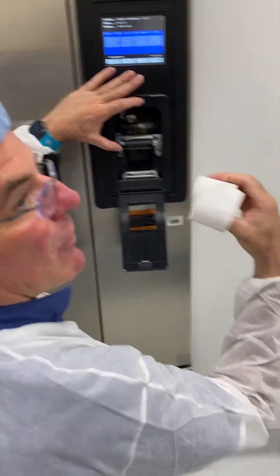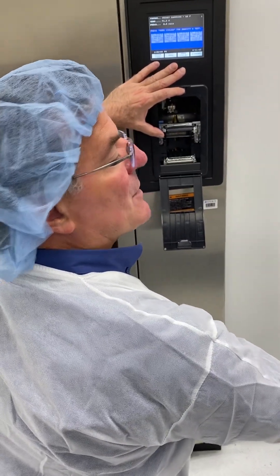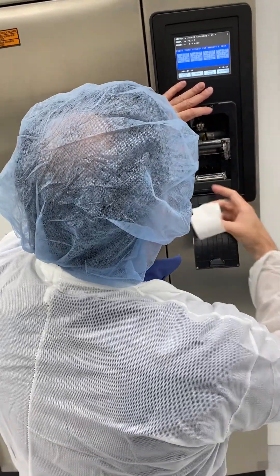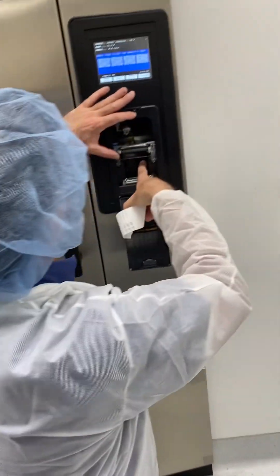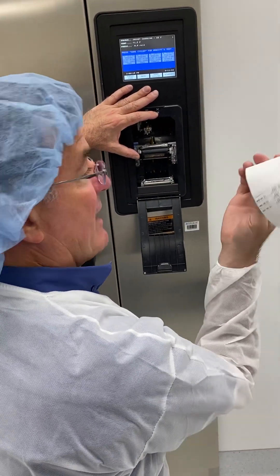Same thing — it rolls from the bottom. This is thermal paper for this machine; it's impact paper for that machine. Same thing — it's got the little nubs right in here that have to go right there.